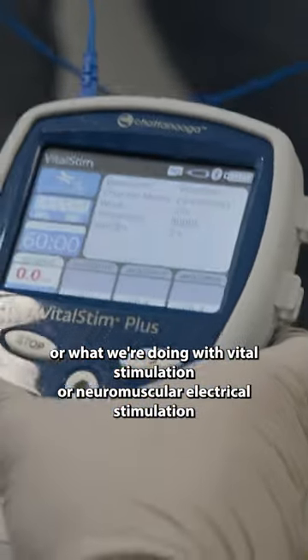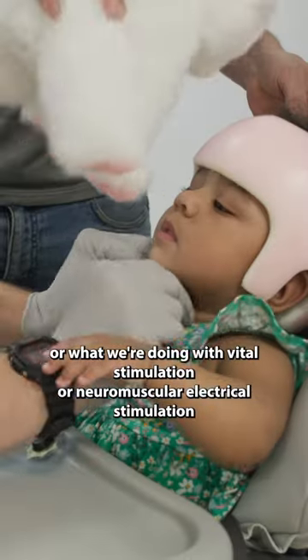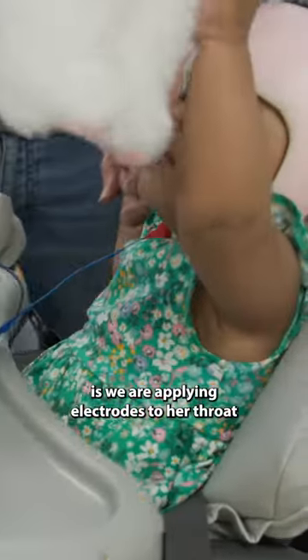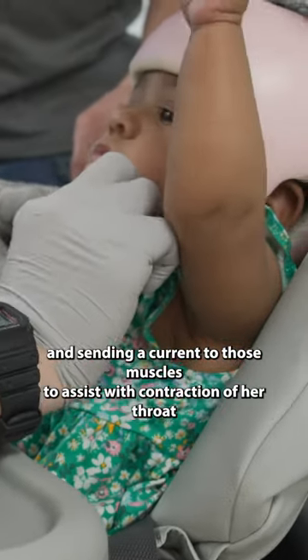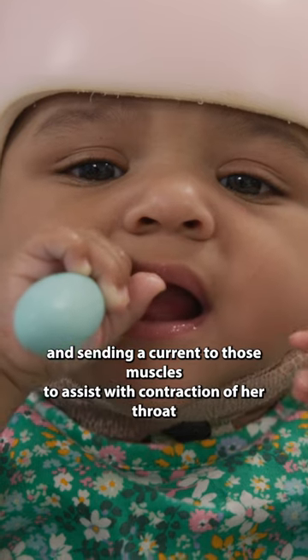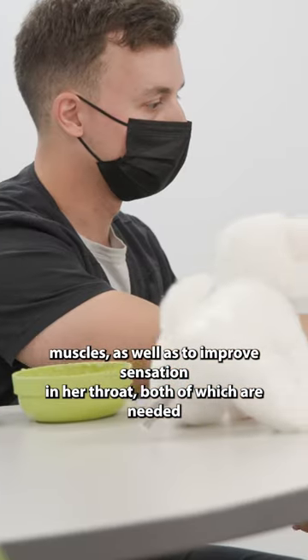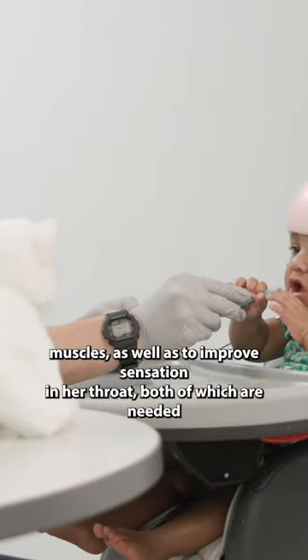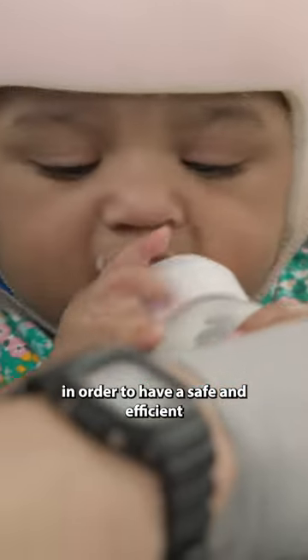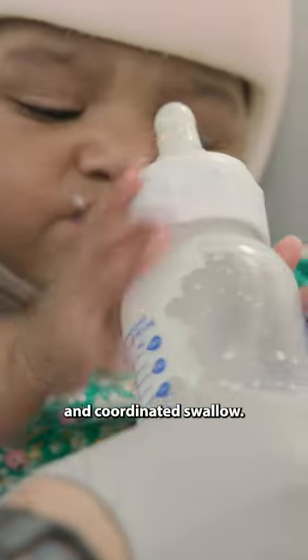What we're doing with vital stimulation, or neuromuscular electrical stimulation, is we are applying electrodes to her throat and sending a current to those muscles to assist with contraction of her throat muscles, as well as to improve sensation in her throat — both of which are needed in order to have a safe, efficient, and coordinated swallow.